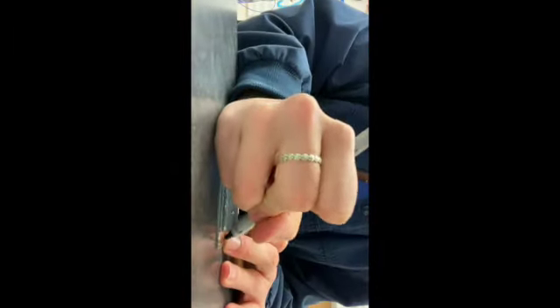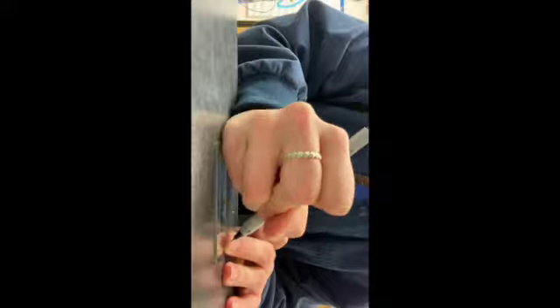Then do the same for the other side. Always label your slides for which side is which. In this case, left is on the top and right is on the bottom. We'll also have the patient's name as well and their signalment.